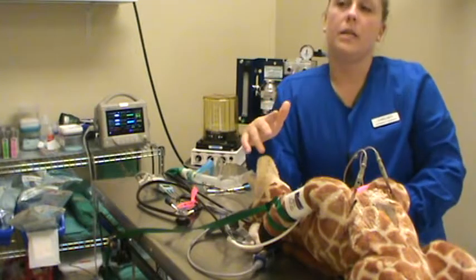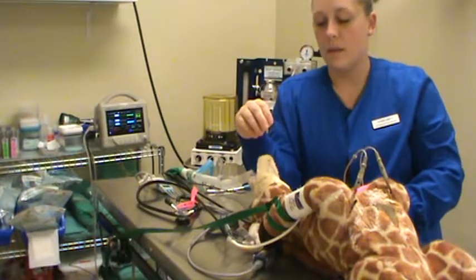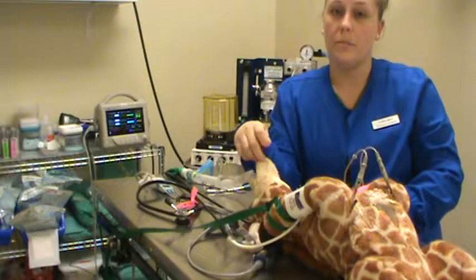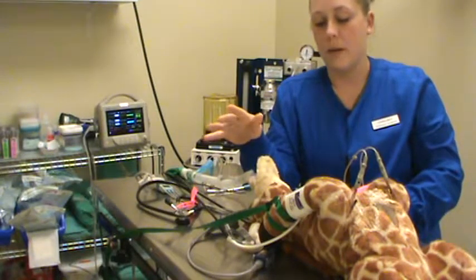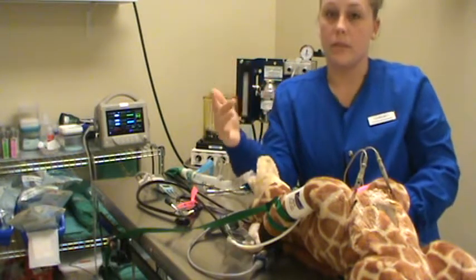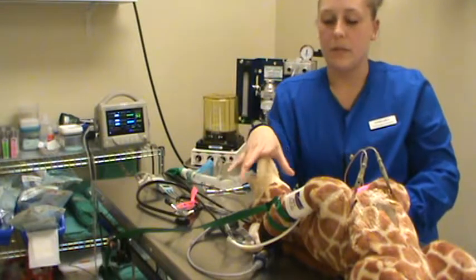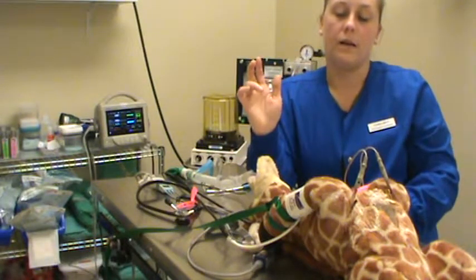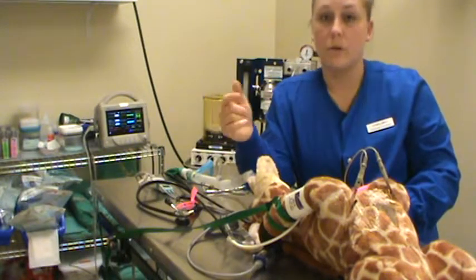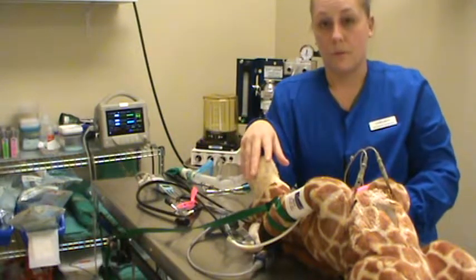So moving on to stage 3, plane 4, which is anesthetic overdose. We are in serious trouble if we've reached this point. We are too deep. We've gone past the point of just deep anesthetic, and we've reached anesthetic overdose. So the patient's reflexes are all absent, PLR is absent, and we have bradycardia and hypotension. So we have a low heart rate and a low blood pressure. We're probably hypothermic as well.